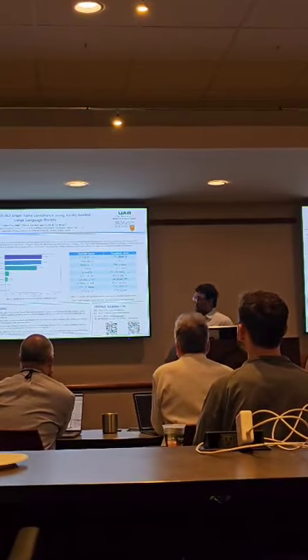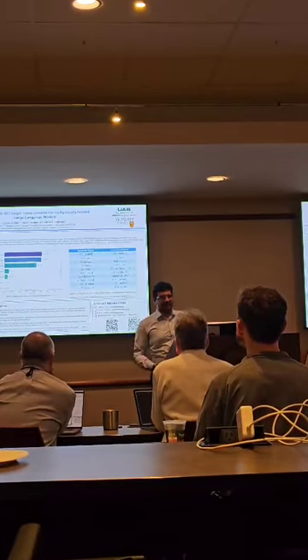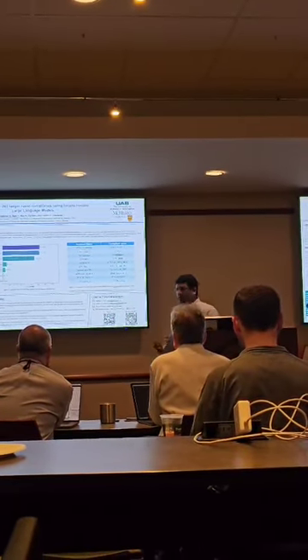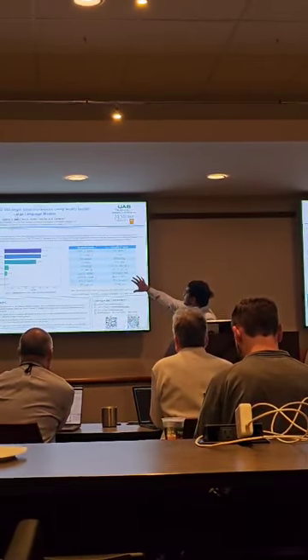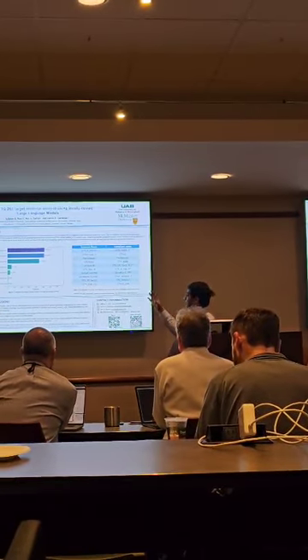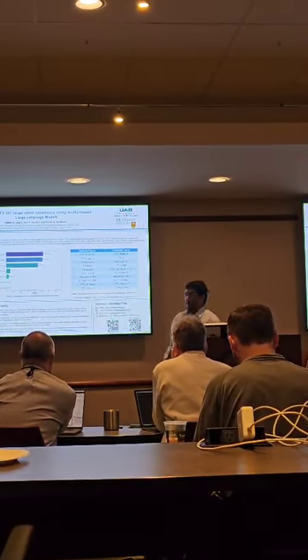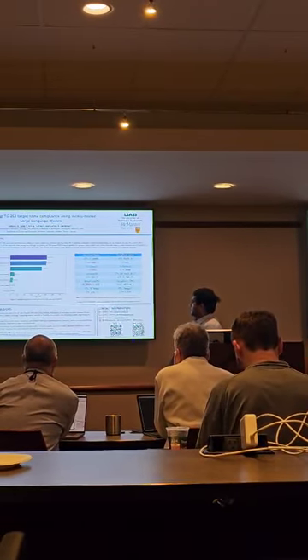Now we looked at the description and said it was PTV radiation therapy, which is, I guess you can say, reasonable for the LLM to say, but we obviously know in this context that it means right. So in this case, all of our outputs were compliant, but they didn't always match the initial contextual information that the physician gave. So this is something we're still exploring. We think we have a good couple of solutions for that.